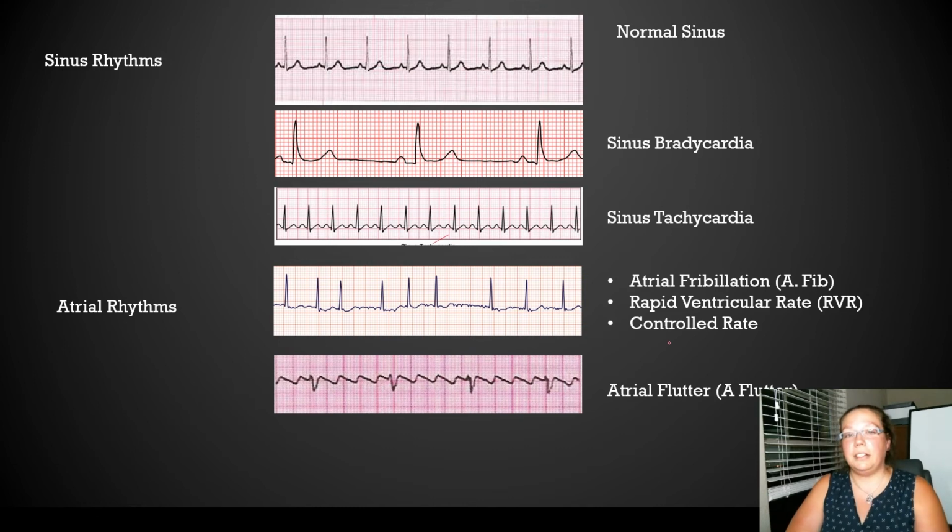And then aflutter, my favorite. Aflutter is when there is some rhythm, there's some organized activity going on in the atrium. They're just doing their thing. They're fluttering like a butterfly's wings. And you get this classic sawtooth.